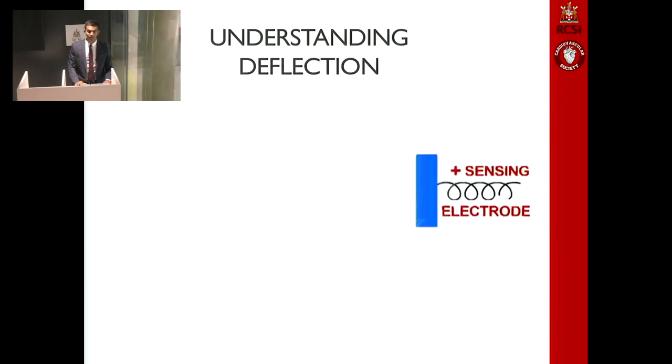Let's get started. An ECG uses electrodes placed on a patient's skin to gain electrical readings of the heart. Let's look at a single electrode on screen right to see how this happens. Imagine current flowing towards the electrode and perpendicular to it. This results in a net, large, positive deflection.